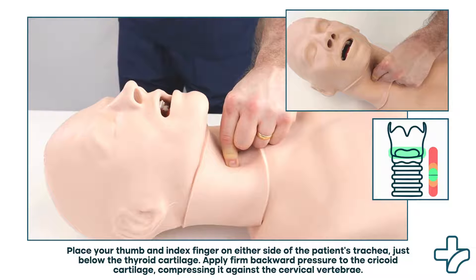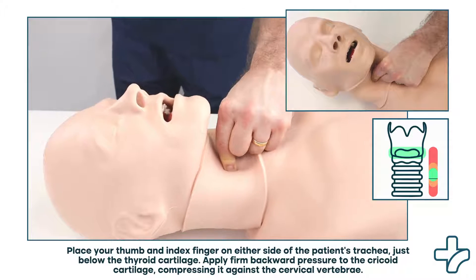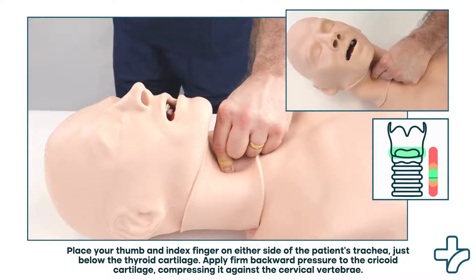Maintain continuous pressure on the cricoid cartilage throughout the intubation procedure, starting before induction of anesthesia and continuing until the endotracheal tube is successfully placed and the cuff inflated.